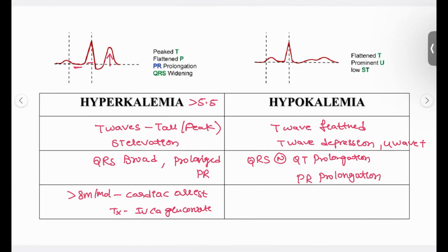So what is the treatment of choice in this patient? You can give KCl IV. So which is more dangerous? Hyperkalemia is more dangerous because it can cause diastolic cardiac arrest. All right, these are the prominent changes that we will be seeing in hyperkalemia or hypokalemia.